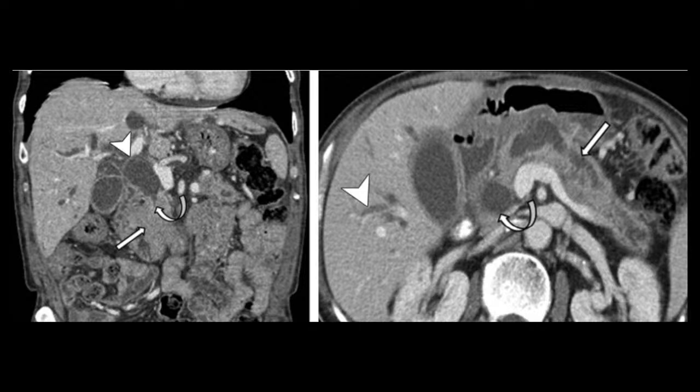Hypointense is the term that we will use for MRI. This is not the term we are going to use for CT images. Okay, hypodense lesions in the liver. So let me tell you, these hypodense lesions, no problem.